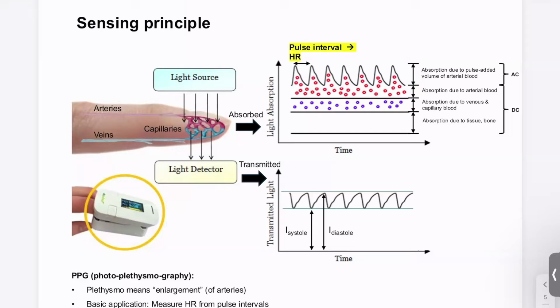Is there like one amplitude, or do the different heartbeats, like the S1 and S2, differ? Yeah, it can change over time. But this is kind of like a steady state, when you have a stable physiology, but it can change over time. Okay, so when you look at this amplitude, what can we get here?